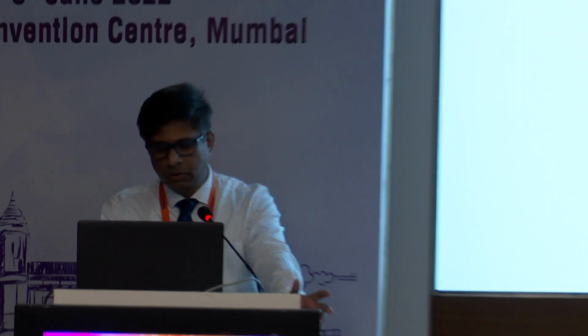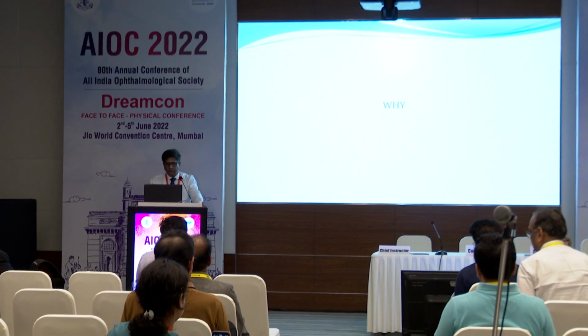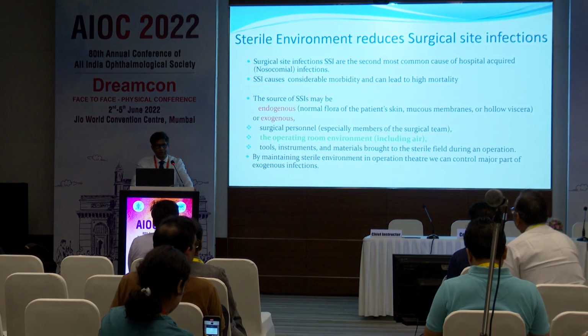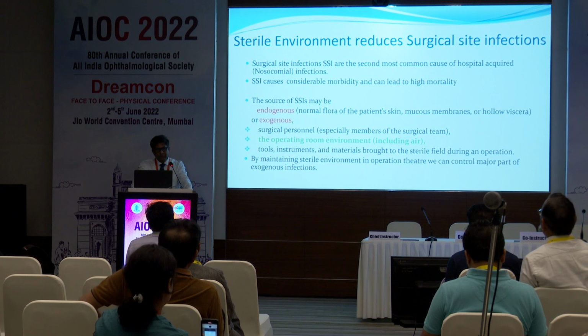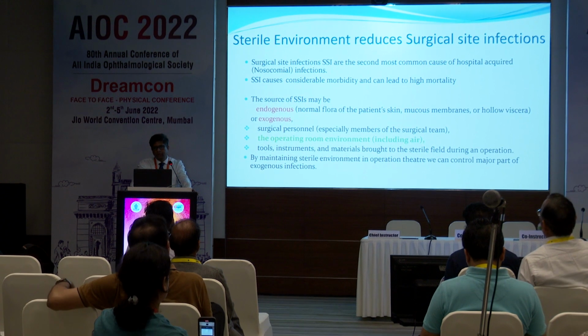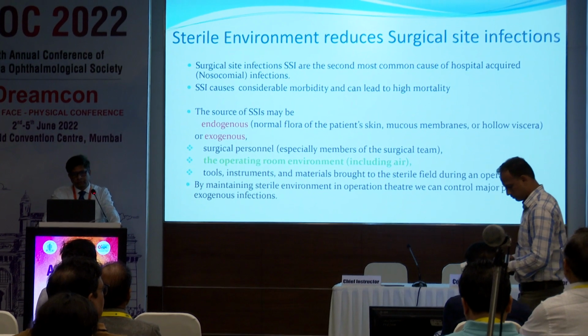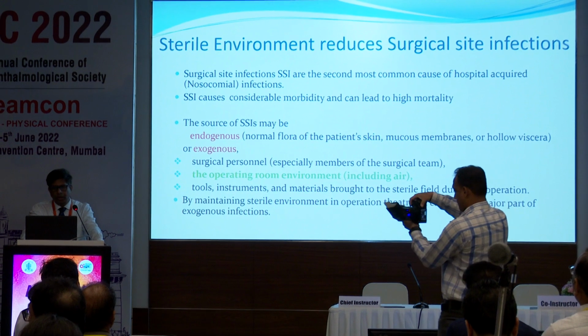I'll be speaking on OT sterilization and maintenance. So why do we need a clean OT? It has been seen that a sterile environment reduces surgical site infection, and surgical site infections are the second commonest cause of hospital-acquired or nosocomial infection. And it causes considerable morbidity and can lead to high mortality.